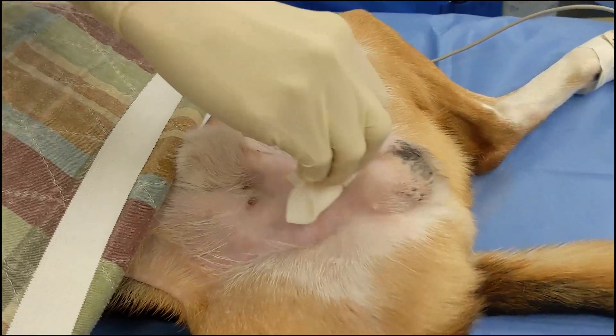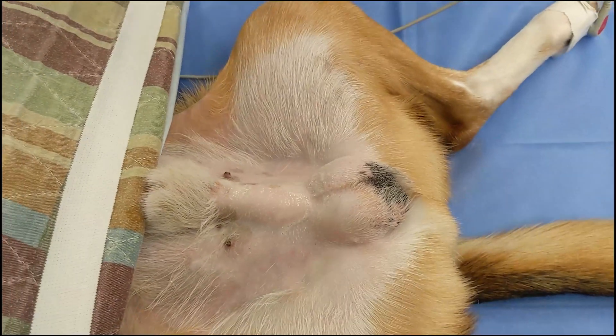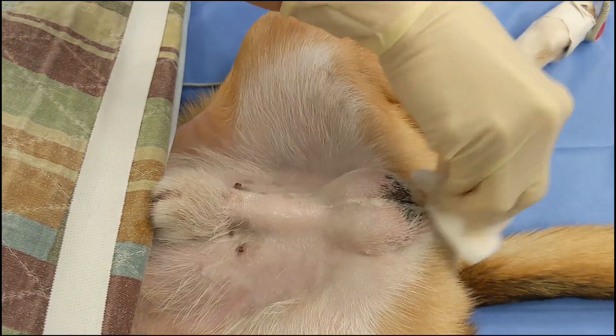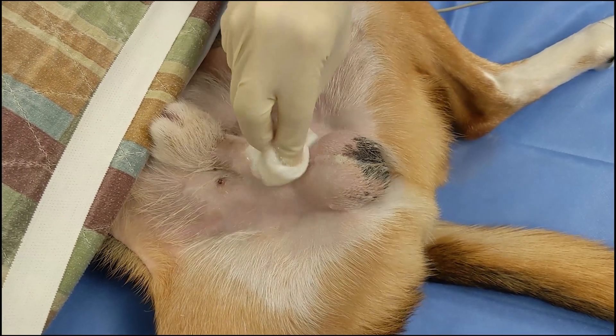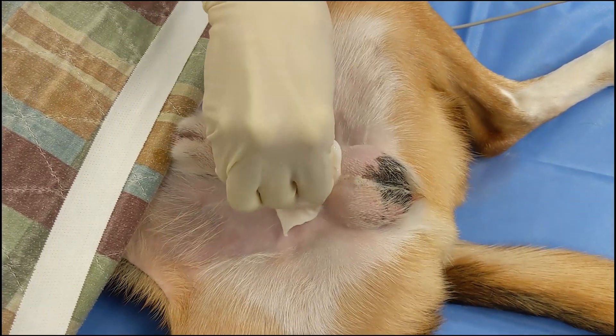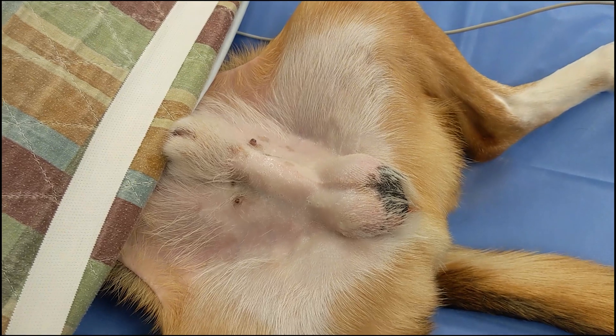When performing a sterile scrub, gauze should never drag from haired skin back towards the shaved and prepared area, as this will drag dirt and debris from the haired area back into the surgical site. Notice how only short cranial and caudal motions are made on midline to prevent this. When the gauze reaches the haired to non-haired borders, it is removed outward in that direction and does not scrub back towards the surgical site.